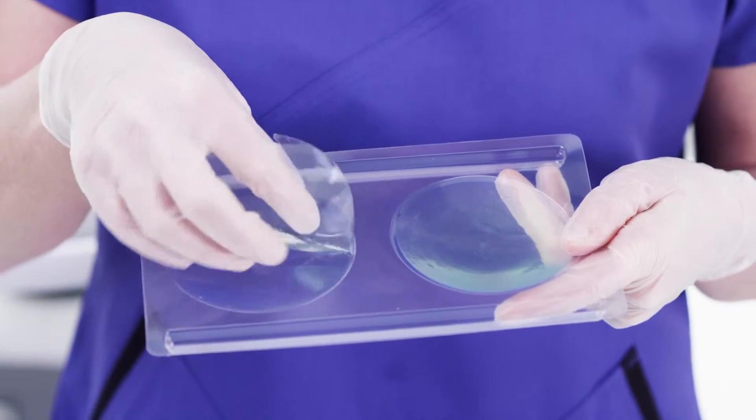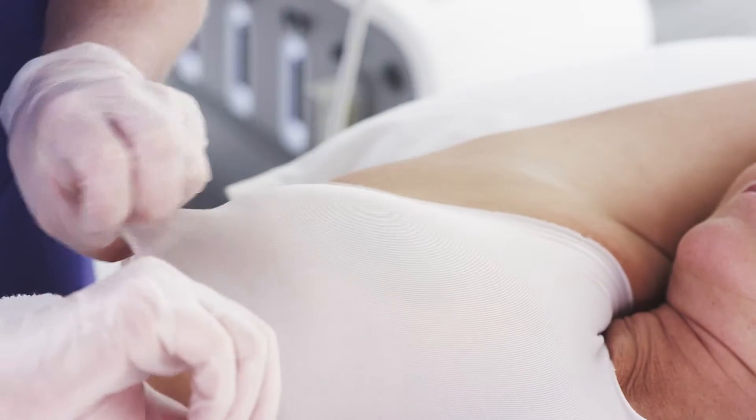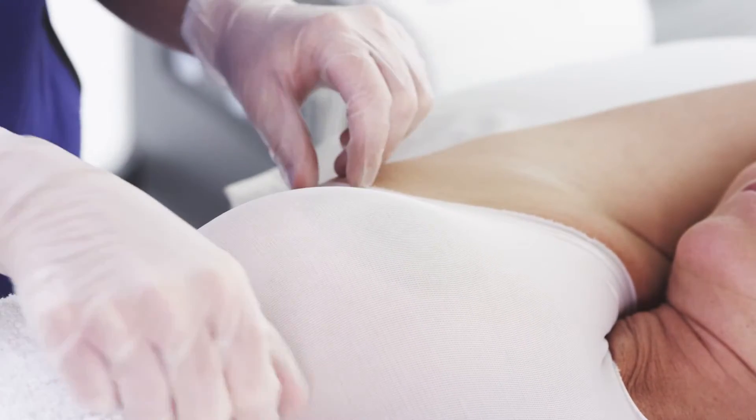Sonos Cine has an exclusive patent on our gel pad, which covers your nipple. Remember, ladies, no pain — the pad protects your nipple. Unlike other ultrasound examinations, this pad ensures that your radiologist can clearly see if there's an area of concern behind your nipple.